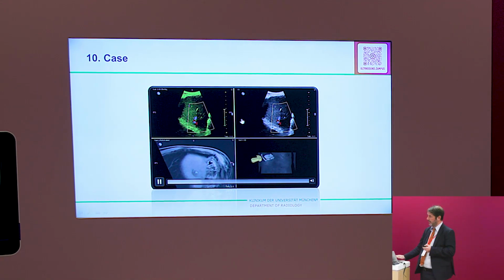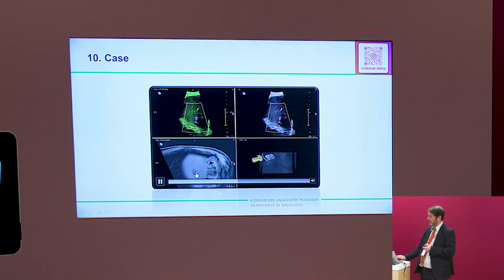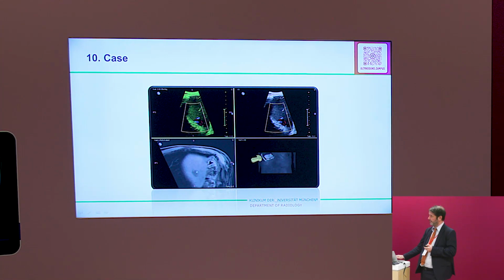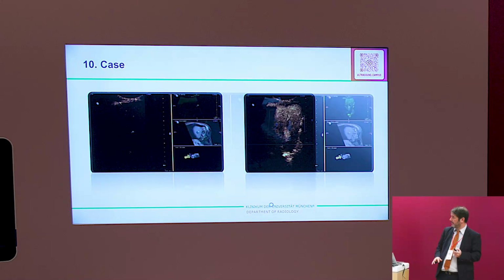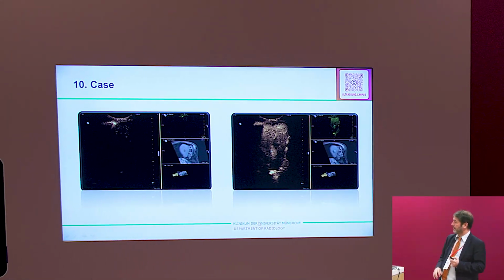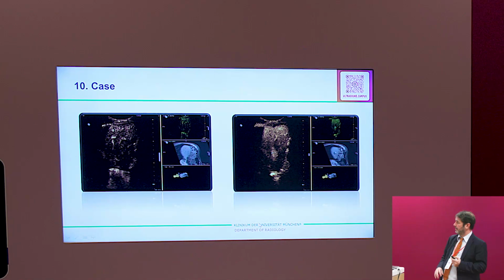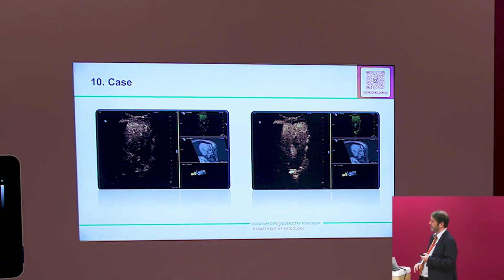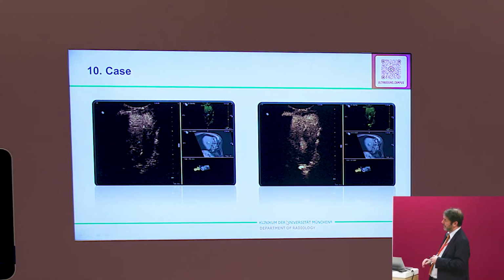But you see in the MRI, the registration was fine, exactly there. So we inject contrast. Take a little bit. There's a marker.